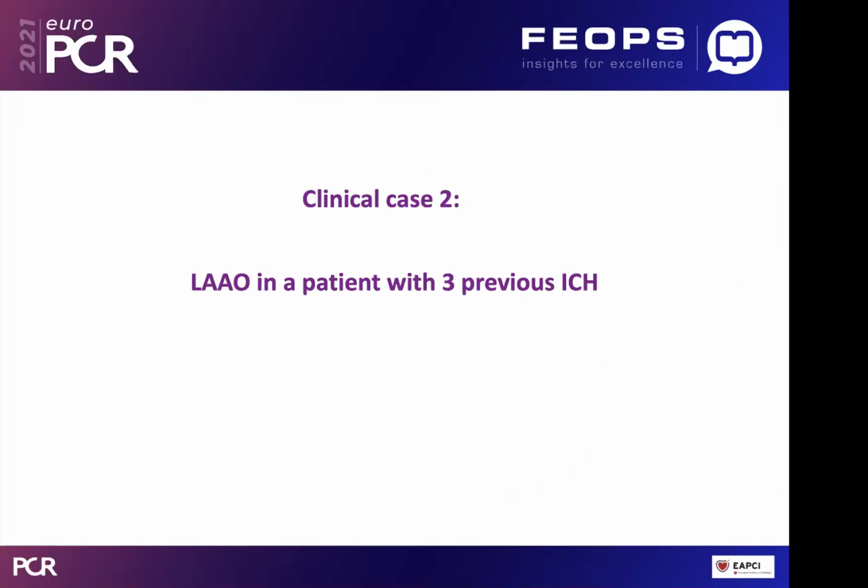Yes, Francesco, there are a couple of questions coming on the chat line. The first one is: is it possible with the FEops HEARTguide solutions to simulate the delivery sheath positions? In other words, from the transeptal puncture towards the LAA. Well, that's the first question. And I don't know if you want to comment on that, Francesco. Yes, Christian, if you remember, we are discussing this argument in many of our meetings. This is a very important question.